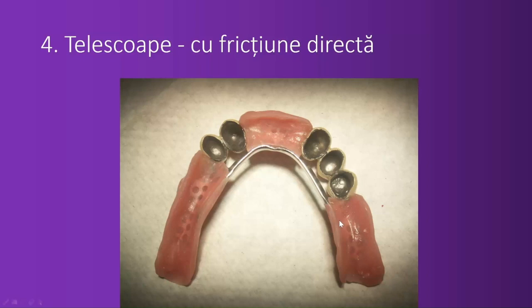It's a denture bridge or a bridge denture. This can be a bridge. You imagine that, right? What is there? Well, there is a saddle, because I want to be able to remove everything in order to allow the patient to clean. But it's a denture at the end.